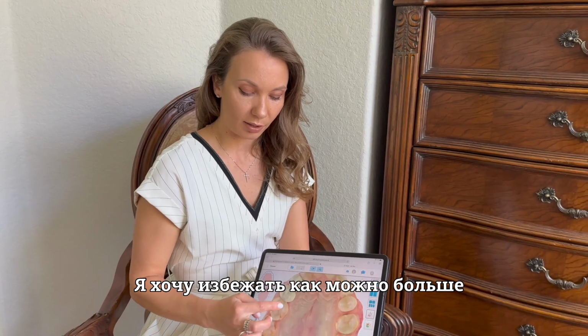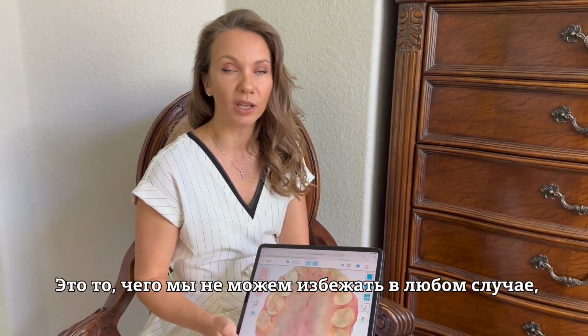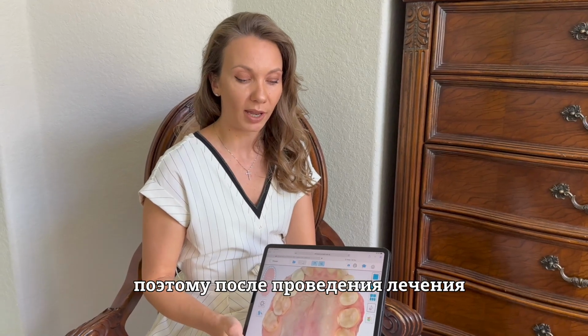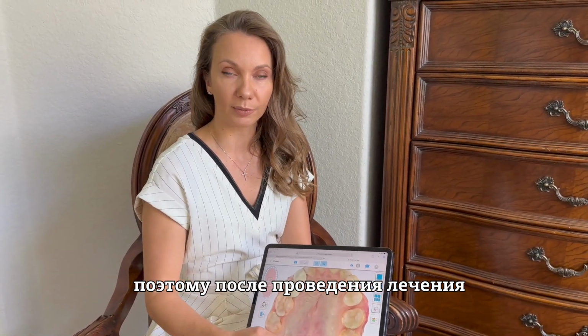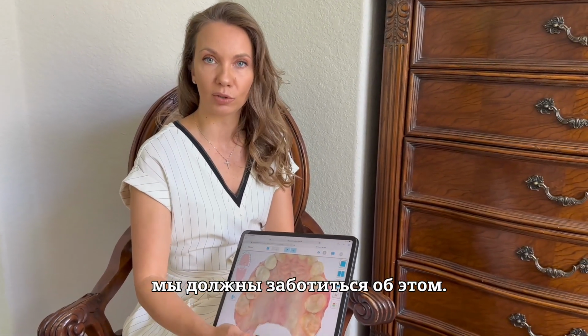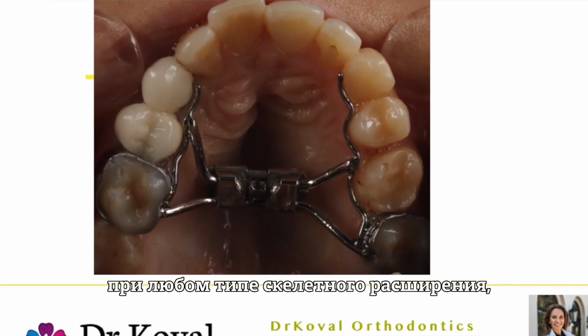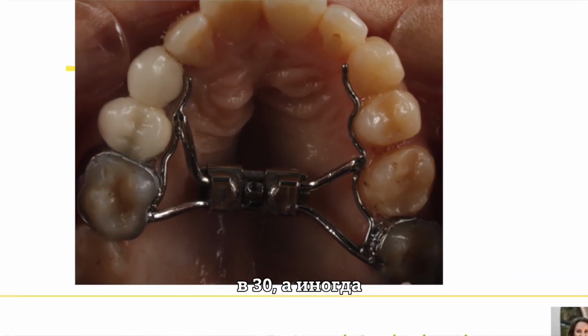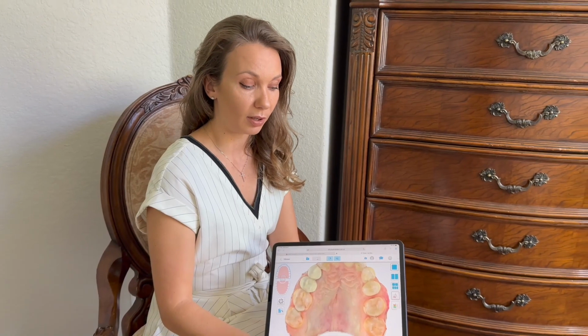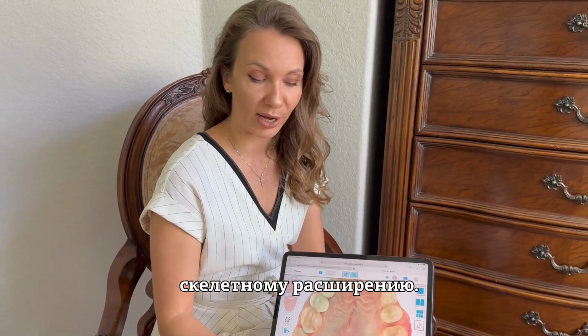I want to avoid molar movement, molar tipping as much as possible, which is the adverse effect of any type of skeletal expansion. And this is something that we cannot avoid in any case. That's why after providing the treatment for the skeletal expansion and after having everything open, we have to take care of that excessive molar tipping. This is always the case with any type of skeletal expansion, that around 30, maybe sometimes in some types of expanders, even up to 50% of expansion is attributed to molar tipping rather than a true skeletal expansion.